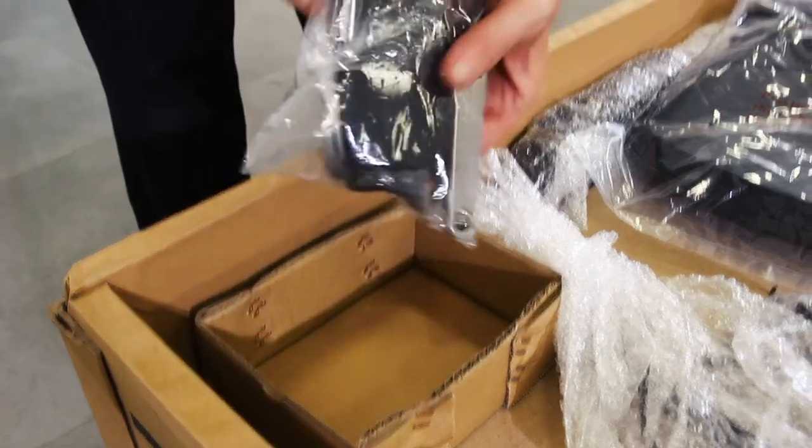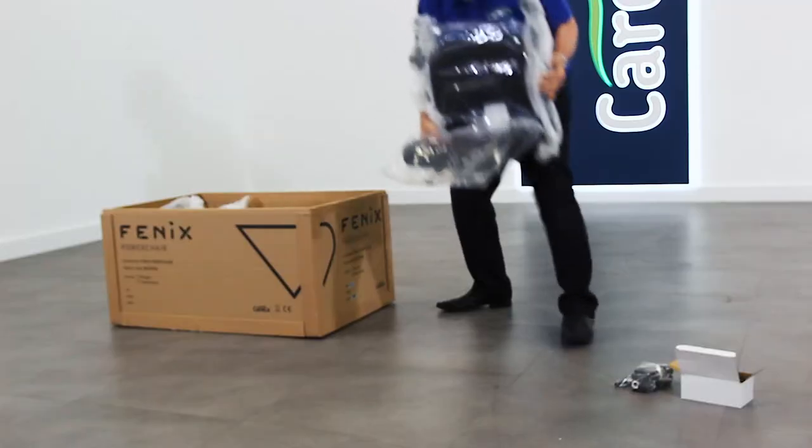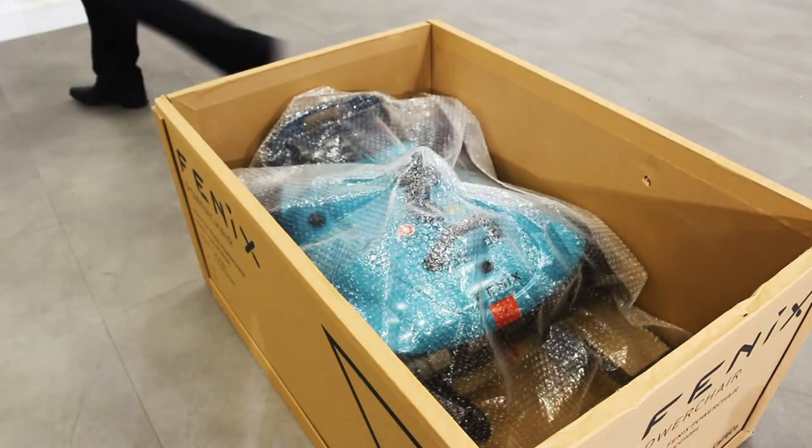You'll also find a small clear bag containing a seat belt, essential knobs and bolts, and a spanner. Set these aside along with the seat and the joystick controller. Remove any excess packaging to access the main power chair body.